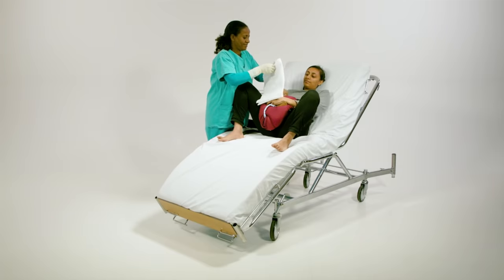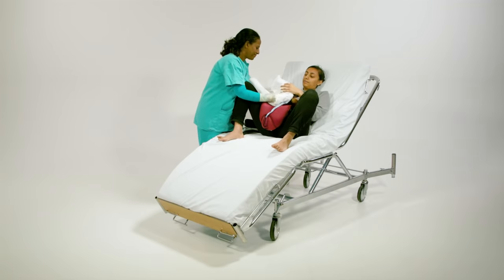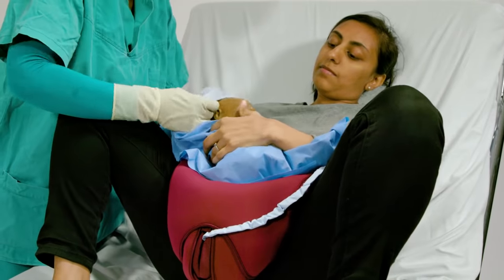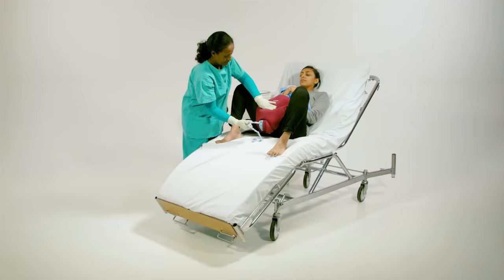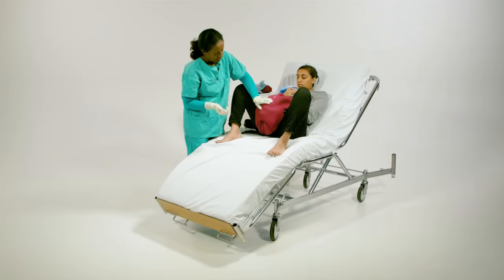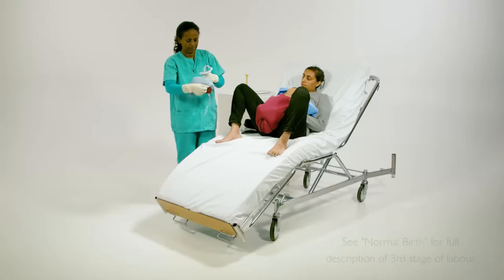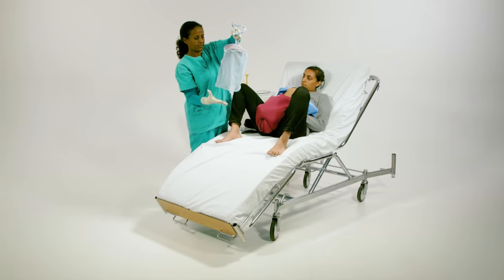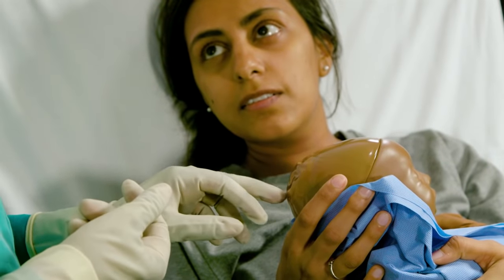Place baby Berthi on the Mama Berthi abdomen and dry before clamping the cord. Provide routine care for the mother and baby during the third stage of labour. Explain to the mother that the chignon created on the baby's head is normal and will subside in a few days.